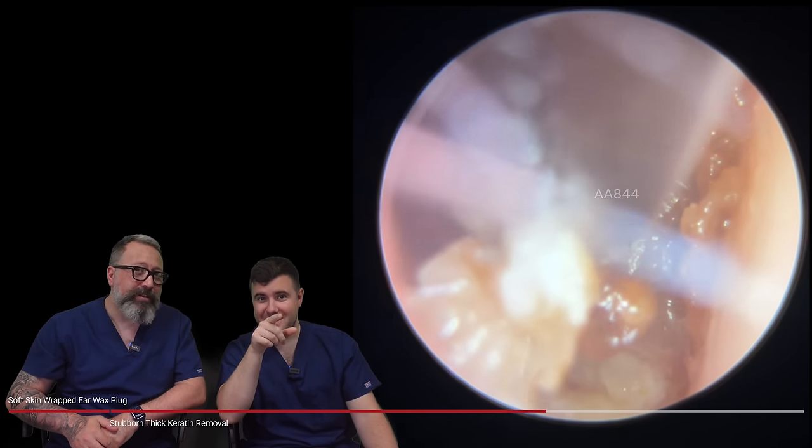That did loosen some of it — you can see how this has actually pulled forward slightly. That would have been the point I thought the patient would have felt at least a little bit of dizziness, given how compact this was over the eardrum. Just trying to detach this side section now. Look how hard it is — that whole piece at the top is tough. Not an easy one to do, especially that deep in the canal.